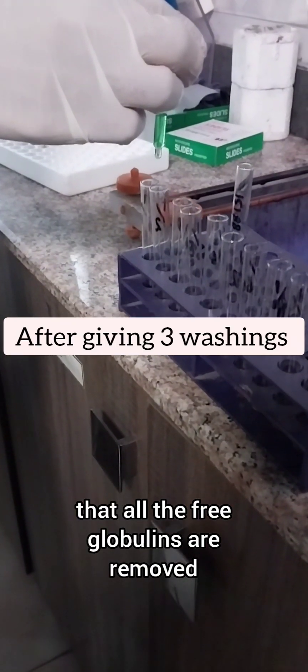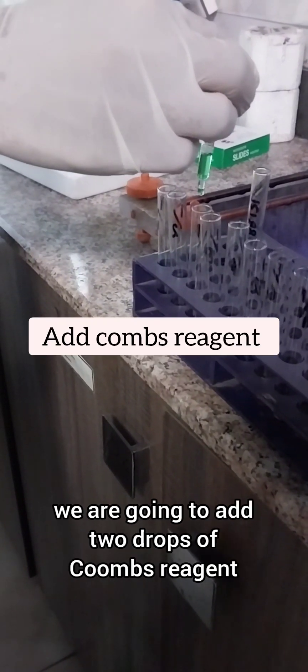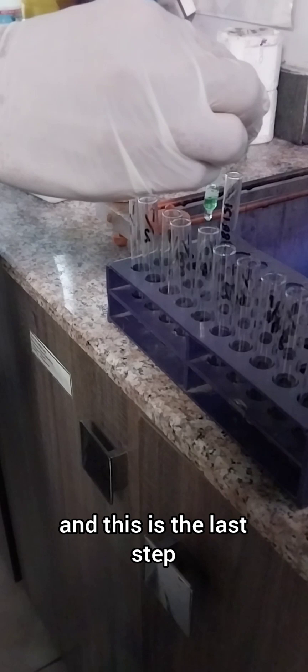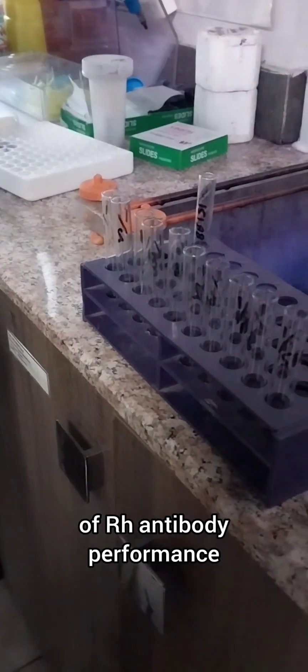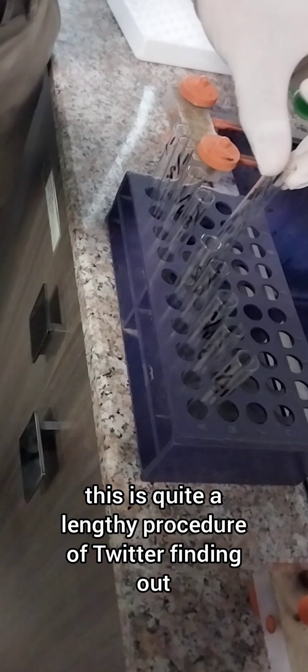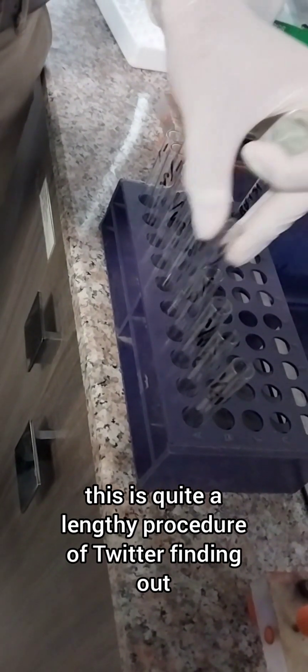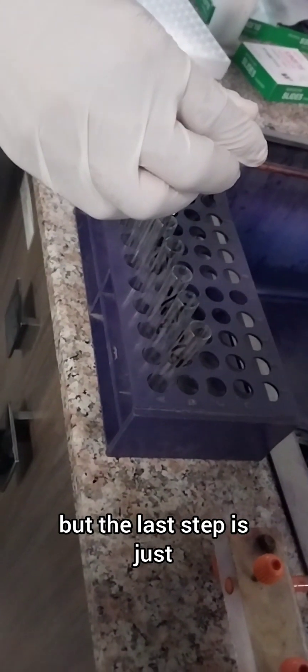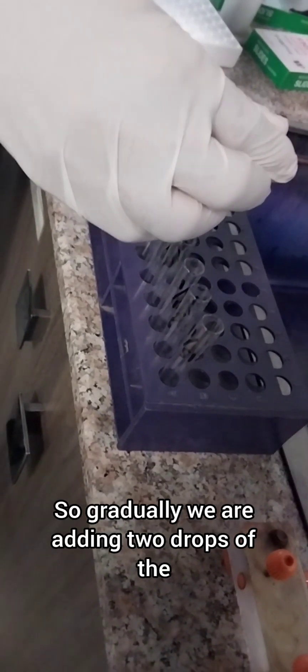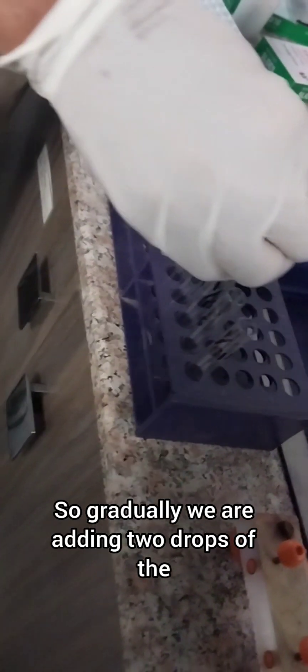So after three washings, to each test tube we are going to add two drops of Coombs reagent, and this is the last step of RH antibody performance. This is quite a lengthy procedure, but the last step is just the Coombs test. Gradually we are adding two drops of the Coombs reagent to each test tube.